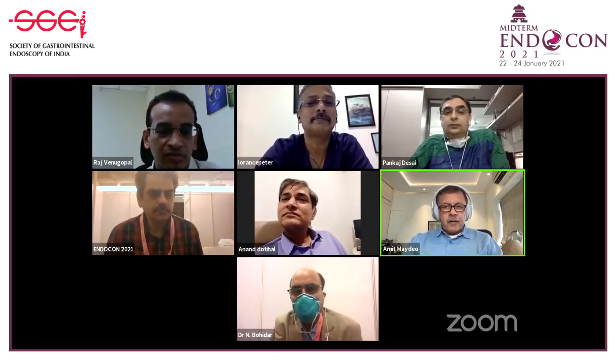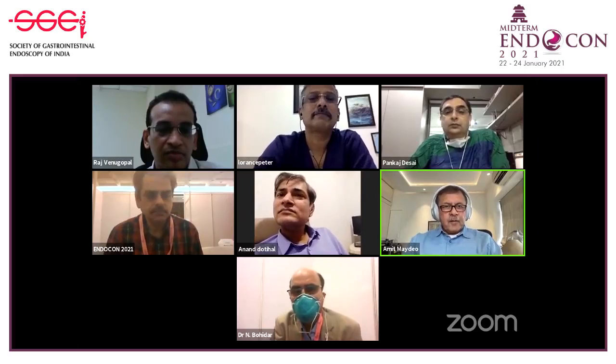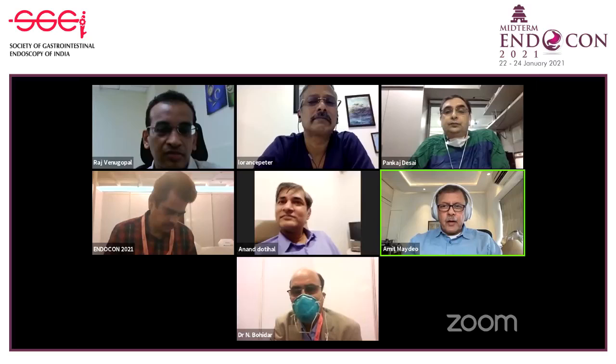Very rarely. In children, the youngest child where we have done POEM is a 3-year-old. But I'll tell you something, there's not much difference between doing a POEM in children or in adults. But in your mind, you have to shut it off. Don't keep thinking that you're doing it in a child, then you'll create a complication. In your mind, once you enter the tunnel, it looks like an adult. So keep on performing the procedure as if you're doing it on an adult, taking all the normal precautions. You don't have to take any other special precautions.